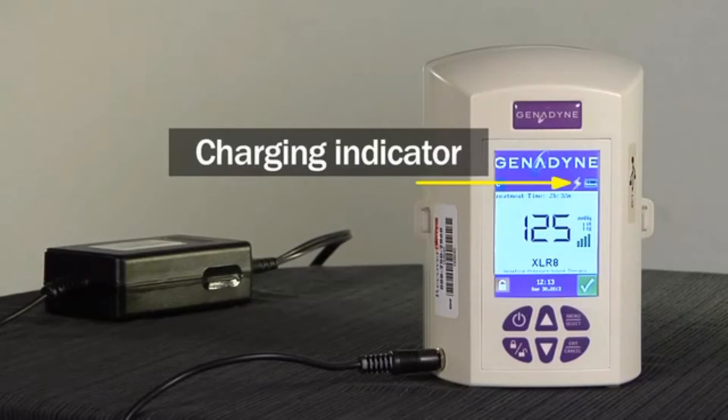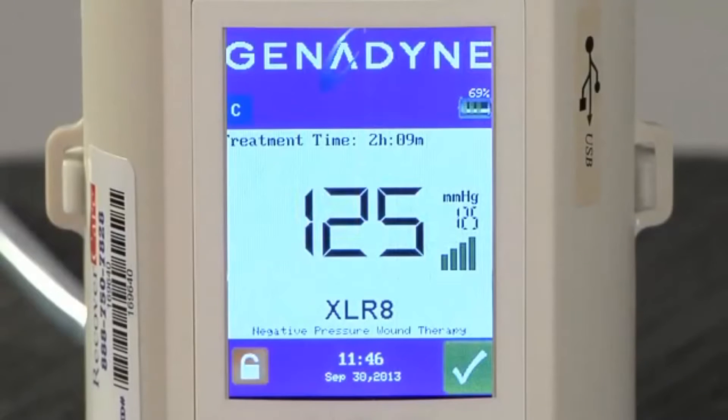The Accelerate takes only 3 hours to charge. The target treatment pressure reading, which is displayed in millimeters of mercury, is located on the main screen. To the right of the target pressure reading is the suction strength icon, which gives both a numeric and visual indication of the negative pressure being applied to the wound. The system status icon is indicated by a white checkmark in a green box in the lower right-hand corner of the screen. When the unit is functioning properly, the white checkmark will be displayed in this green box.